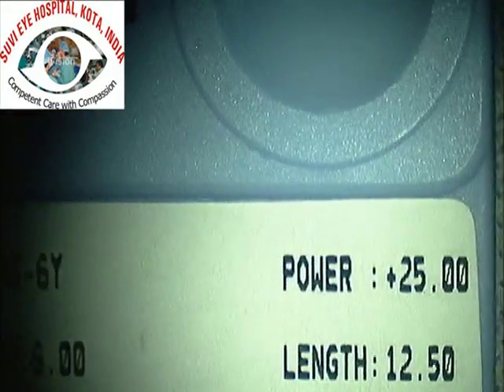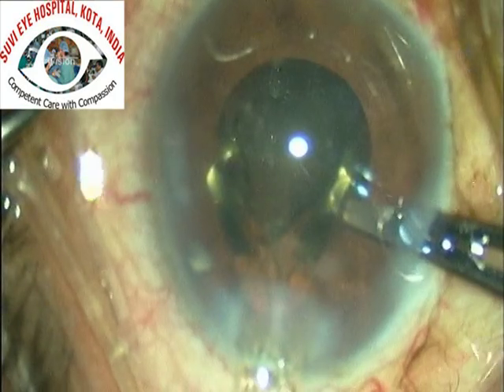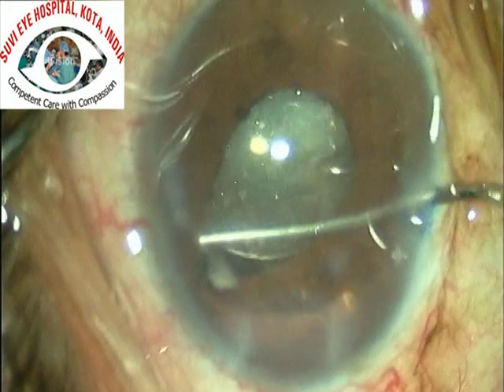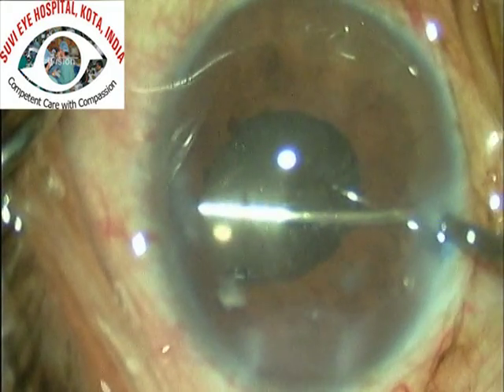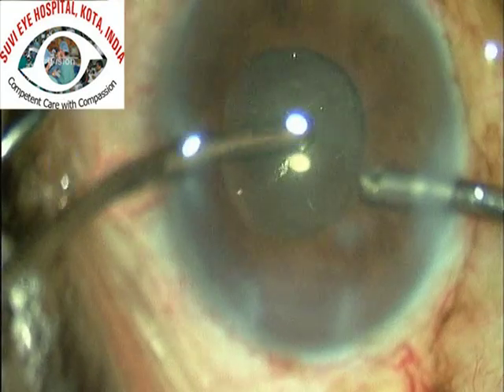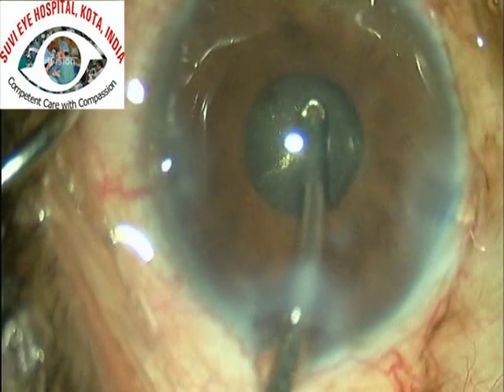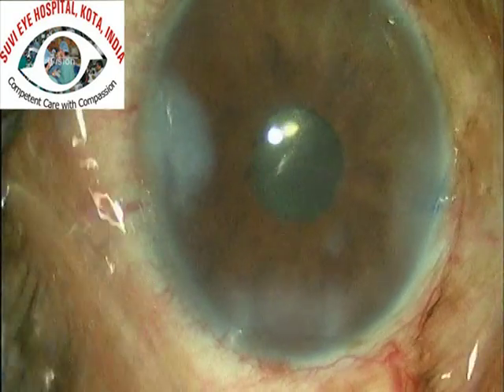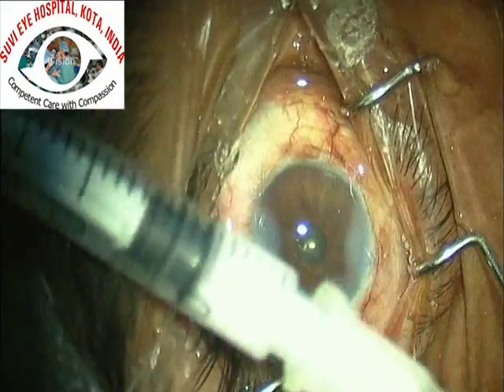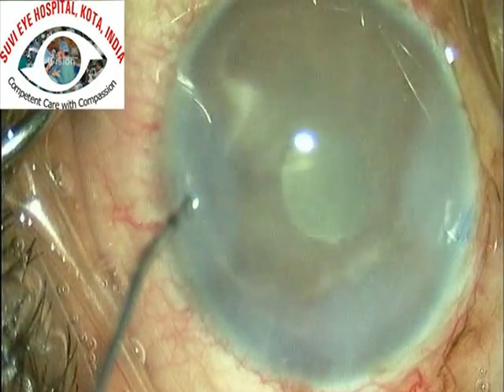We implanted a standard hydrophobic acrylic IOL in this case, and the IOL was carefully dialed into the bag. Some of these traumatic cases may have compromised capsular bags or compromised zonules, and then the surgical technique needs to be varied accordingly. Because there is increased trauma with manipulation of the iris, we must do a good anterior chamber wash at the end of the surgery to remove any debris present in the anterior chamber.